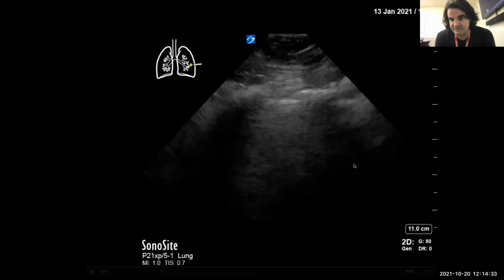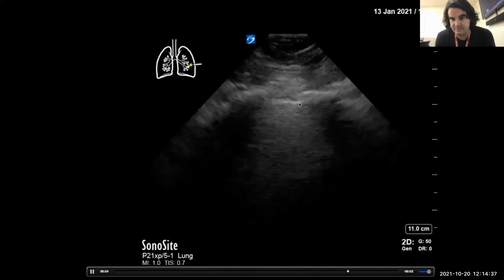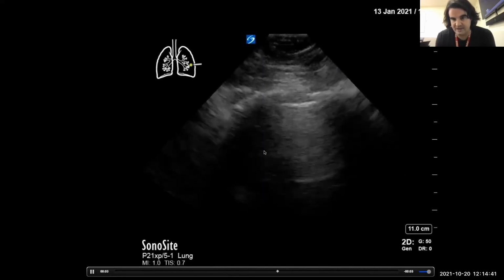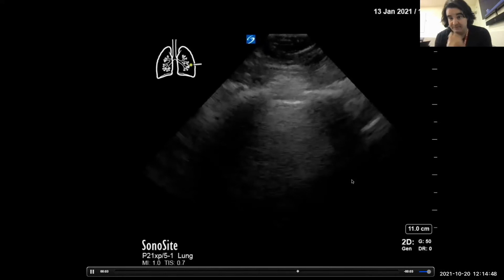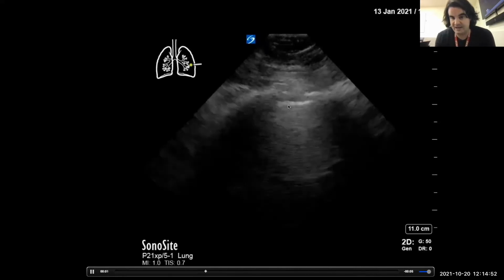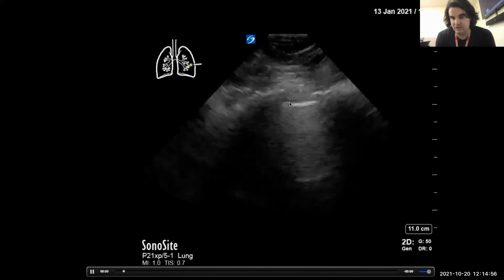Looking at the left side of the chest wall, it was fairly banal. There's a hyperechoic line there. There's the rib margins, this is kind of the bat wing appearance. So you have dropout below the ribs because the sound can't penetrate below the ribs. And you have this quite obvious sliding here, this hyperechoic line, which is just normal lung.